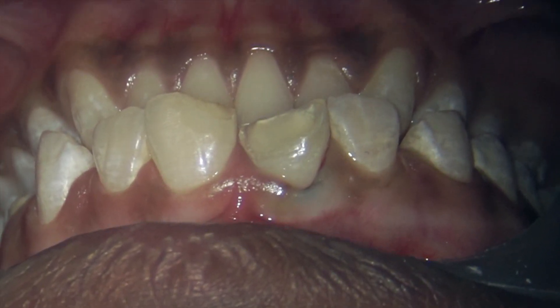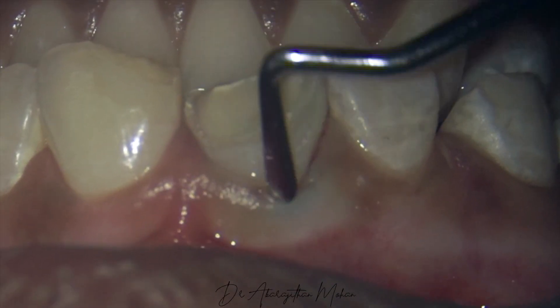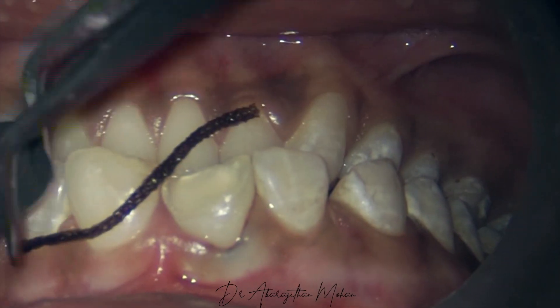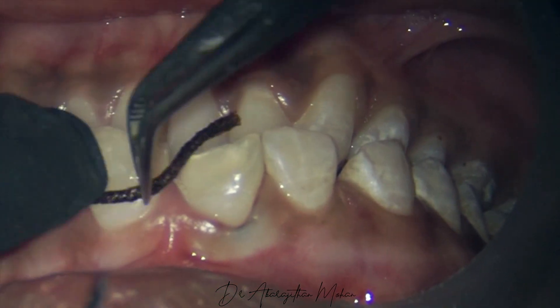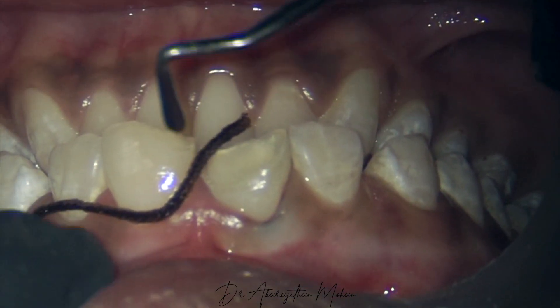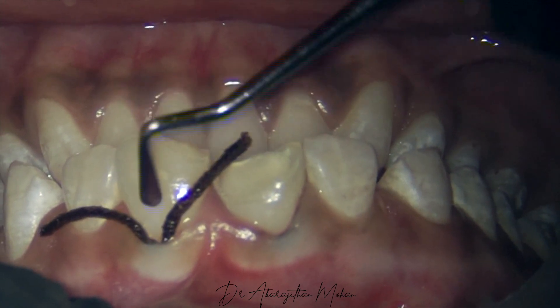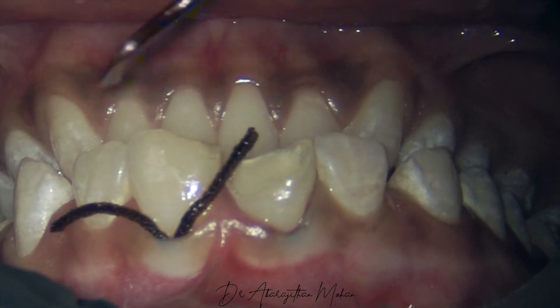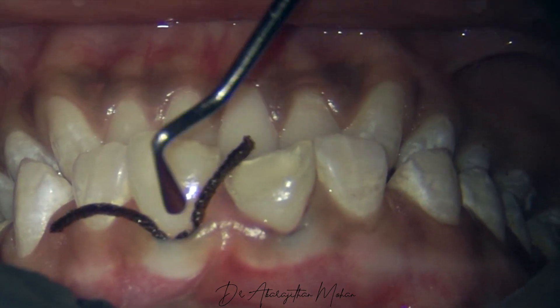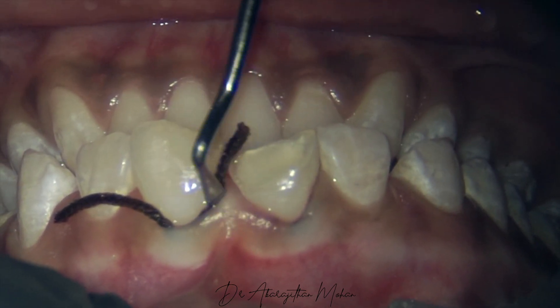As you can see here on the palatal side, I'm not going to place the cord deep inside, as we are going to do the preparation only on the labial side. This is the right way of placing the cord. A lot of times people tend to place the cord too superficially. When you place the retraction cord properly, it should not be visible — that is when you know that the retraction cord has been placed well enough.